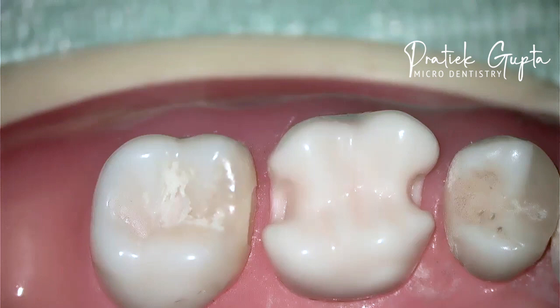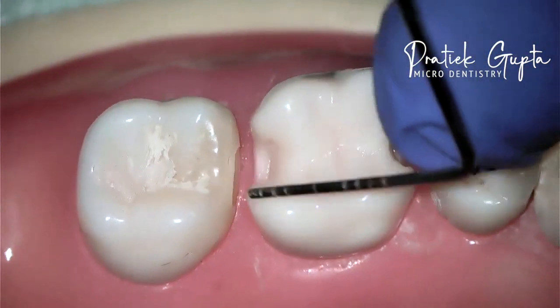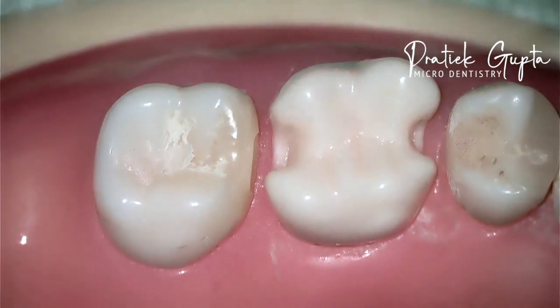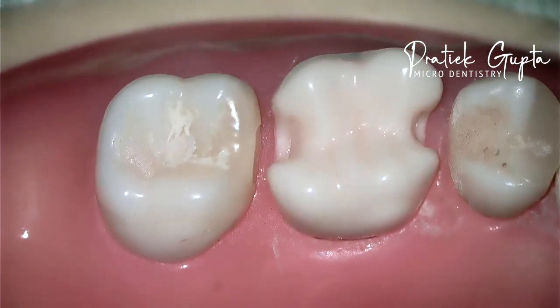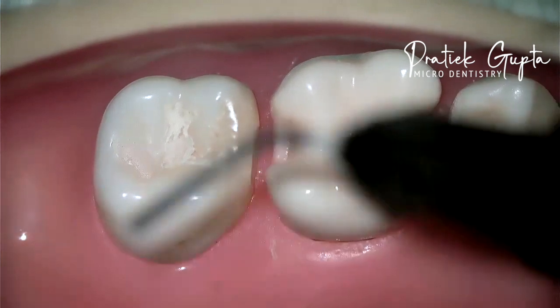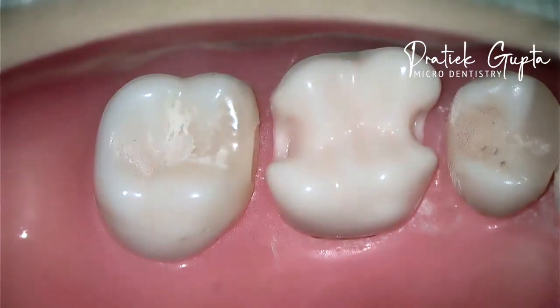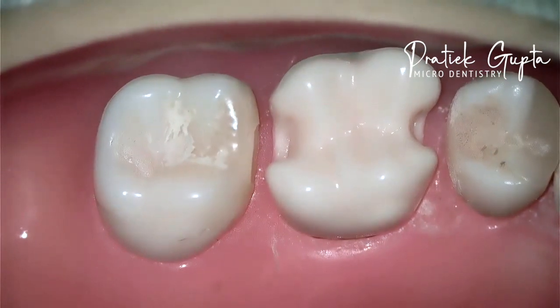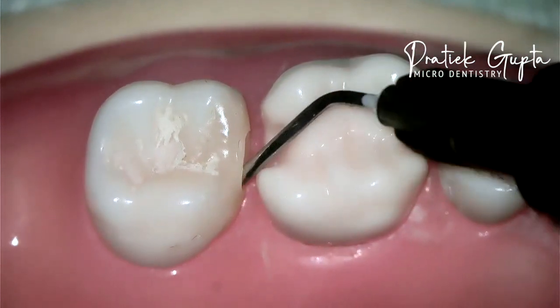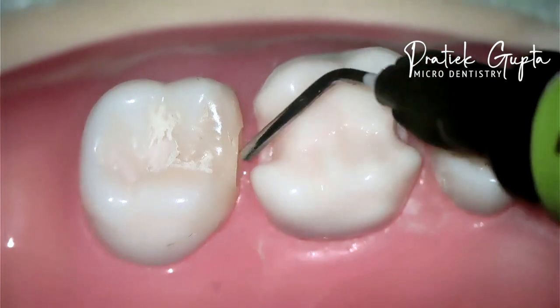Let us move to the second part of the video: how do I restore an opportunistic access like this? There are two ways in my eyes as to how you can restore — there might be other ways also, but this is how I do it. One is either I just do a freehand, wherein I understand that the contour of the tooth is good and I don't want to alter it.